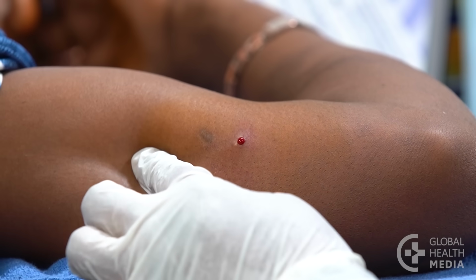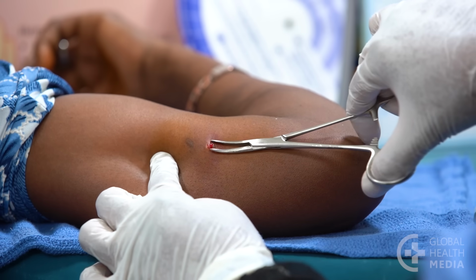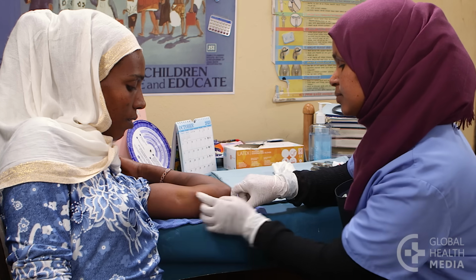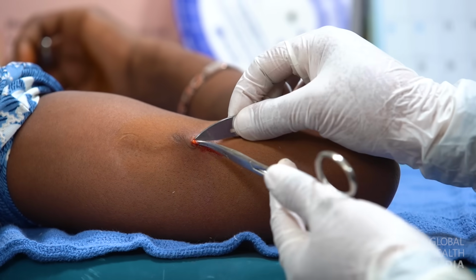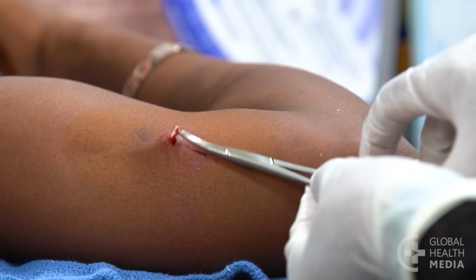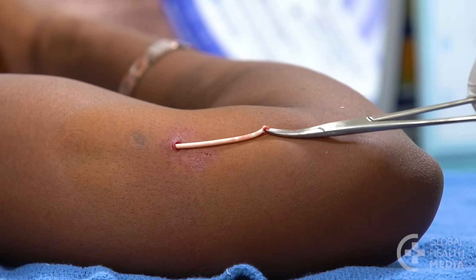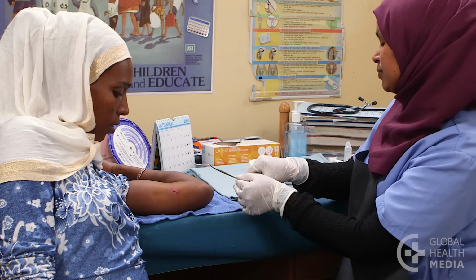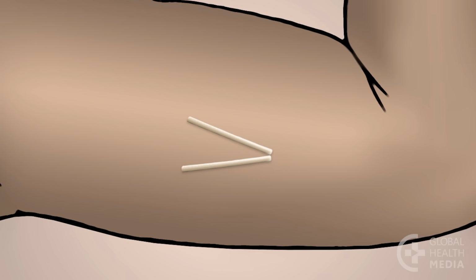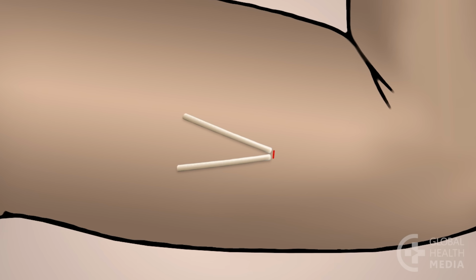Push the rod toward the incision. When the tip is visible, grasp it with your curved forceps. Scrape fibrous tissue with the dull side of the blade to free the rod. A 2-rod implant can be removed using a longitudinal or perpendicular incision.